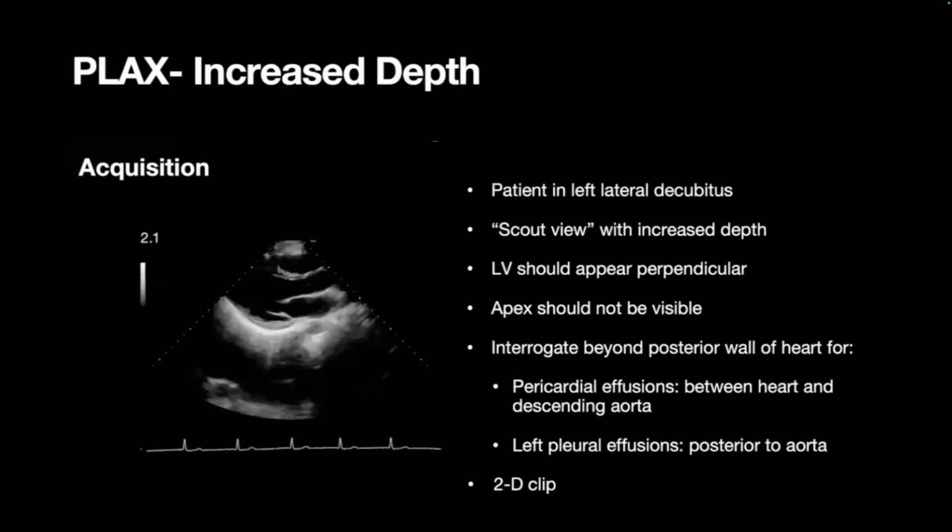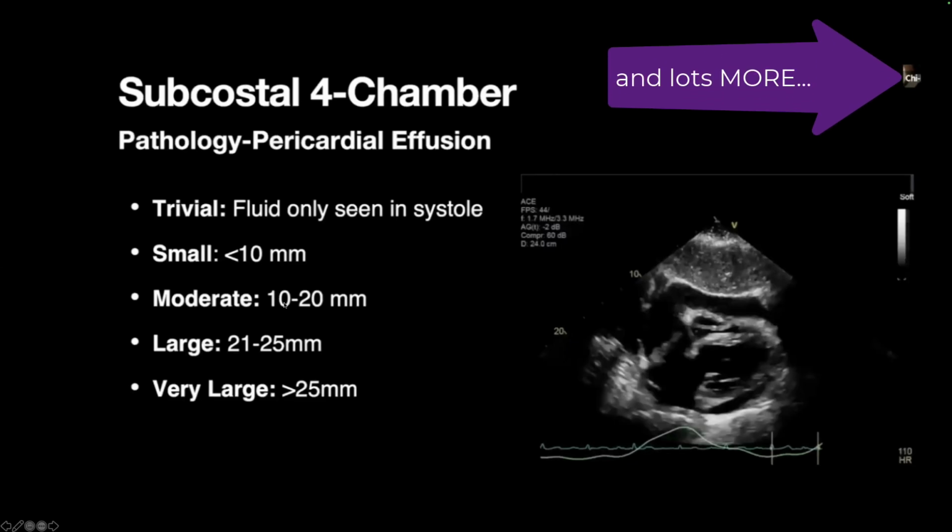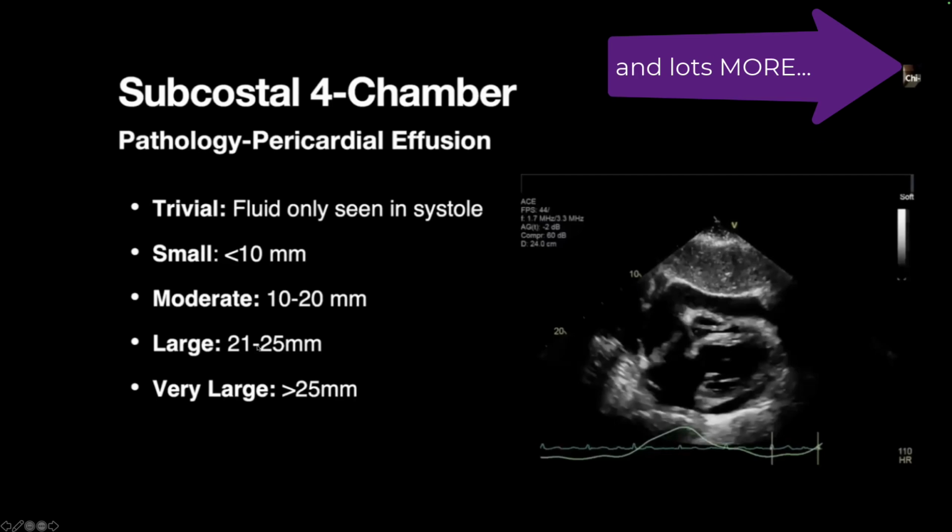Pleural effusion in relation to the aortic, or in relation to the aorta? So yeah, excellent, yes. So this is the aorta. If we can see an echolucent structure here, indicating fluids, then if it is here, it will be anterior to the aorta. So this is pericardial effusion. And we can divide the pericardial effusion according to its size, whether it is small, less than 1 centimeter, moderate between 1 and 2, or large above 2 centimeters.